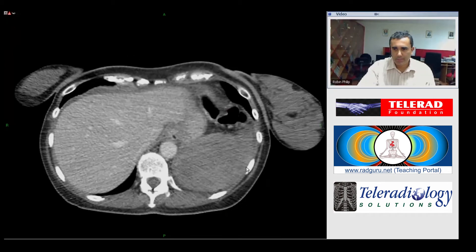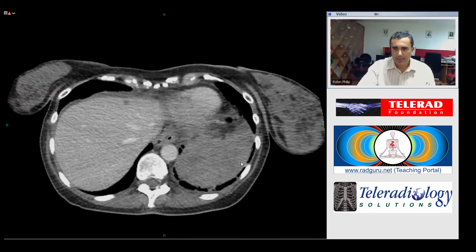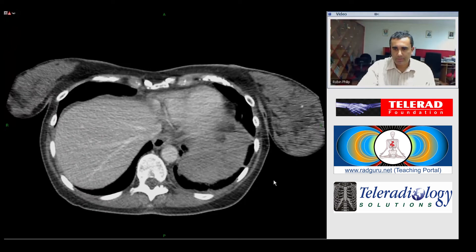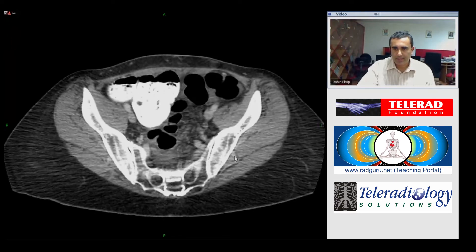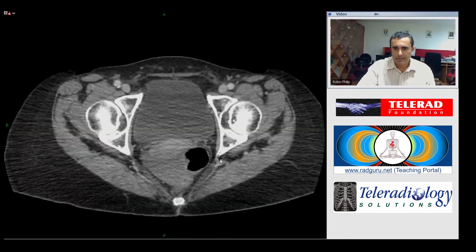The hematoma has then tracked through the splenic capsule into the subphrenic space and has tracked down through the peritoneal cavity, resulting in pelvic hemoperitoneum. This is a recognized complication of colonoscopy described in the literature.